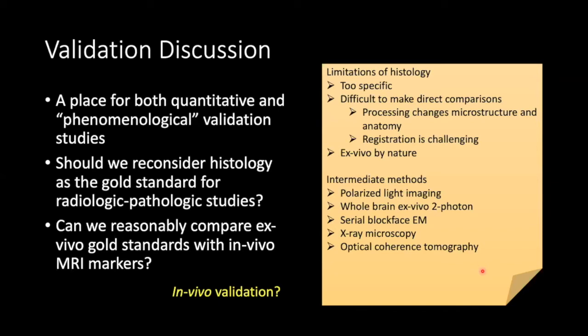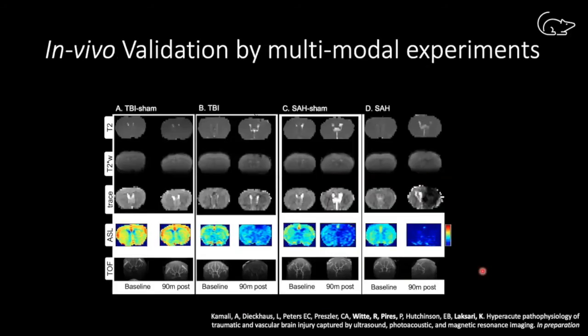And that's not unreasonable. People have done that for fMRI, certainly, using 2-photon imaging to look at the hemodynamic response, and so on. And there's already even 2-photon, I think, of the acute microglial response, I think that's Tori and McGavern, in brain injury. So I think there's the potential there to use that for microstructural MRI as well, although we'll probably have to move beyond just 2-photon.